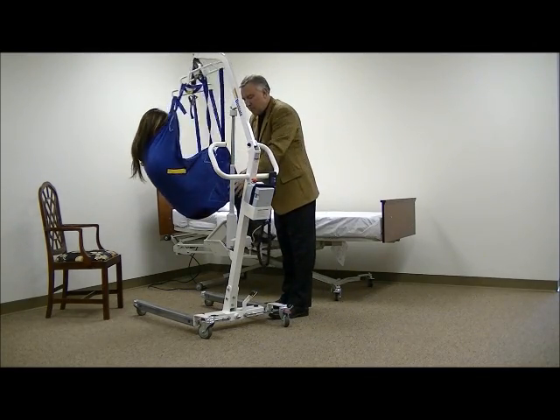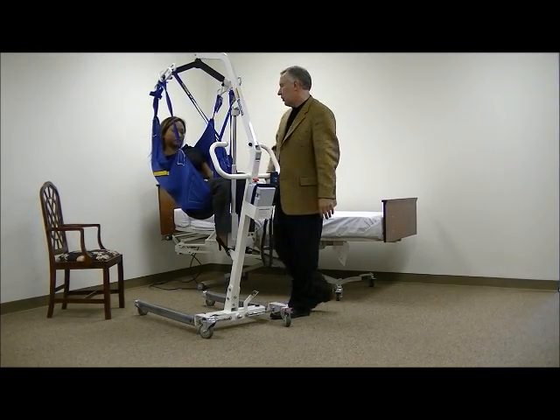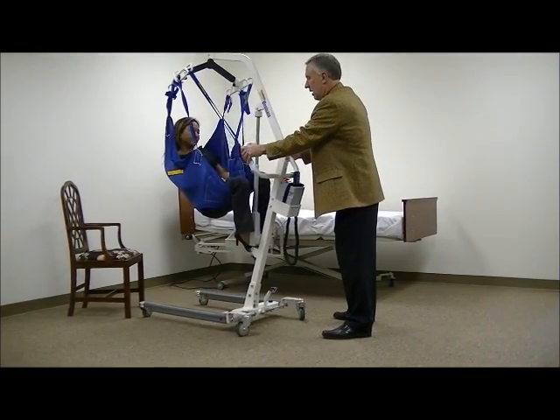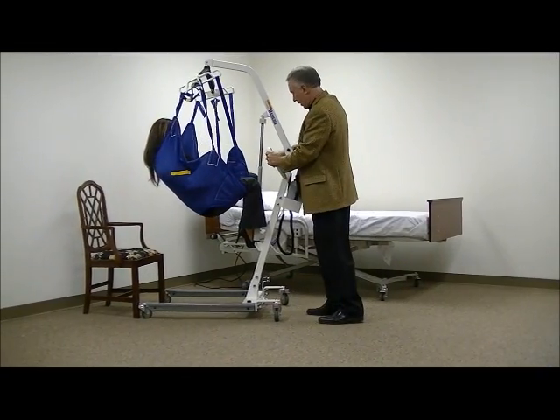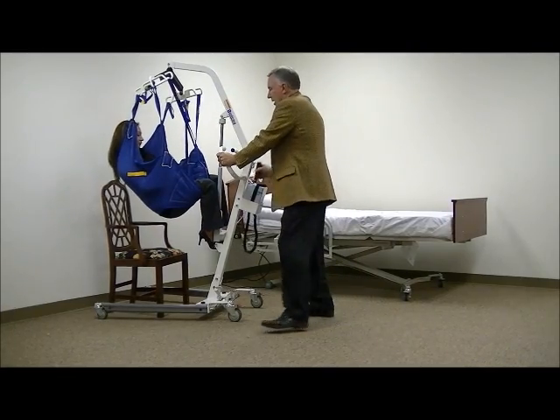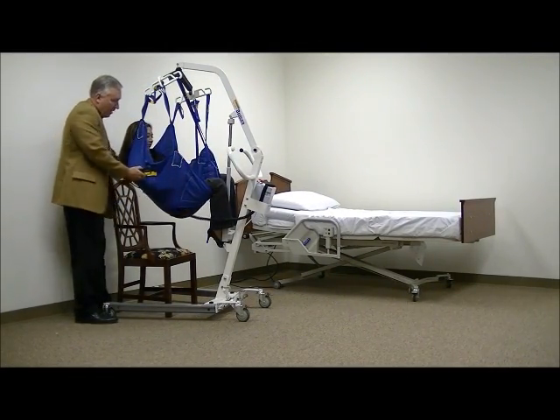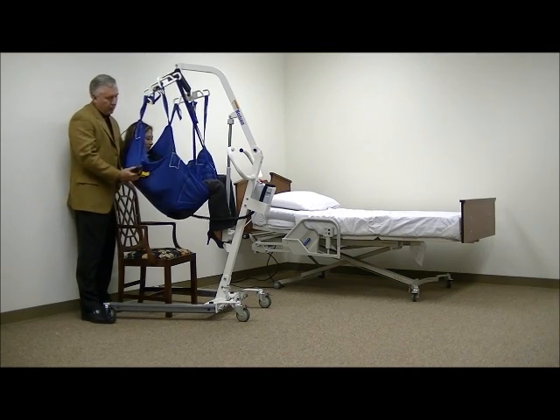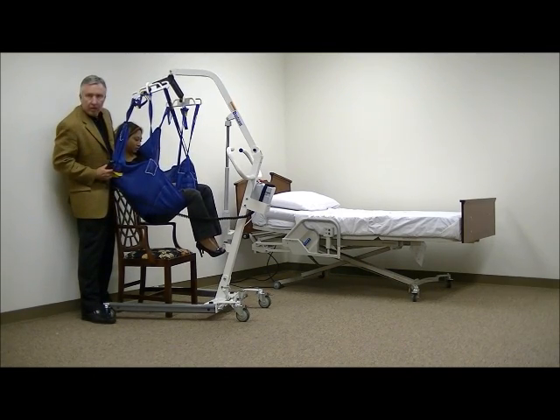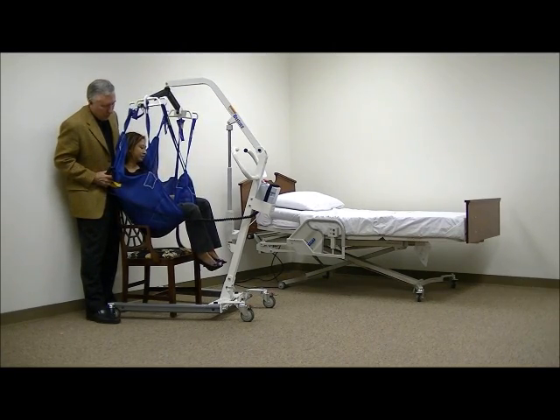We turn here. Being extra cautious about the individual, and you can see again how close you are to the hanger bar, or to the actuator. Open up the base. Now, in this position, you may need to give somebody some assistance in getting back where they need to be in the chair, so you can use these handles on the side to help get the person positioned properly in the chair when you lower them down.